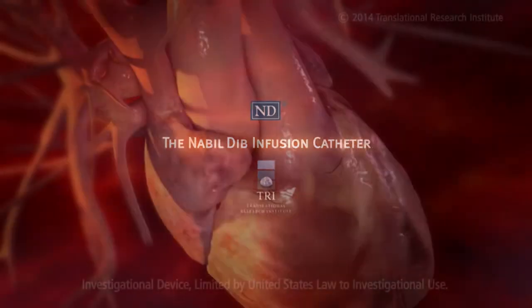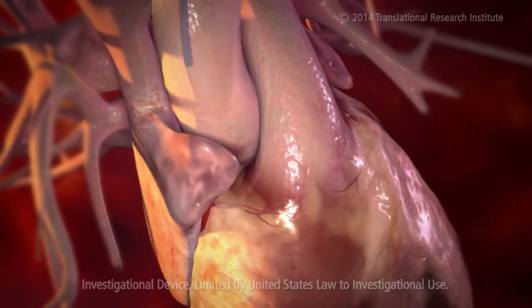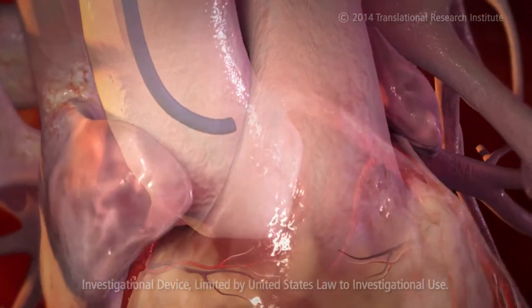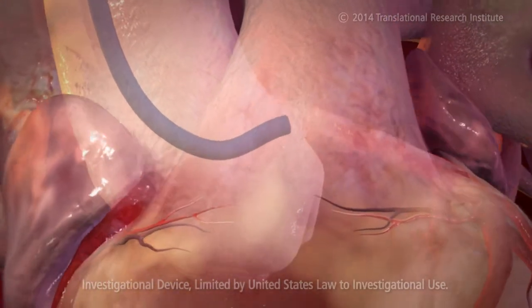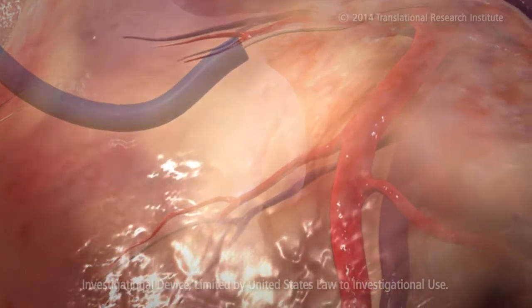A guide catheter is introduced into the femoral artery, navigating through the aorta and across the aortic arch, accessing the main coronary ostium. A flexible guide wire is introduced through the catheter into the artery and is advanced toward the distal end of the vessel.